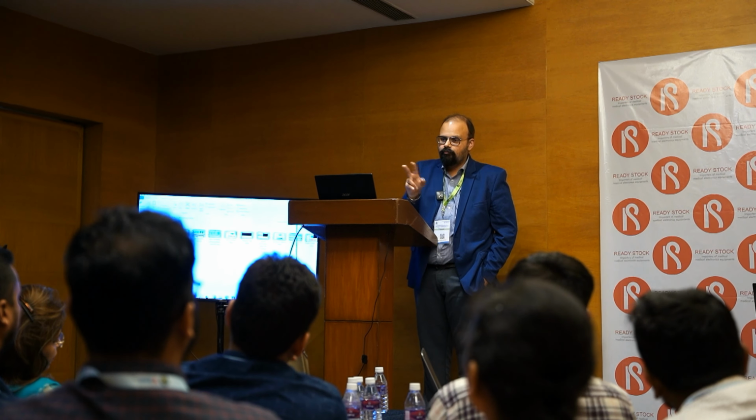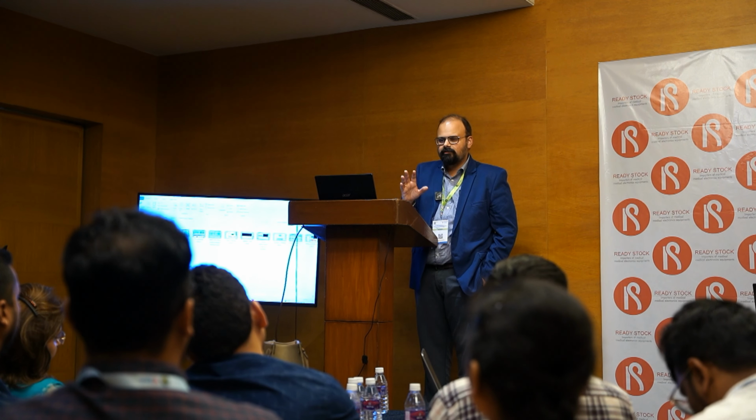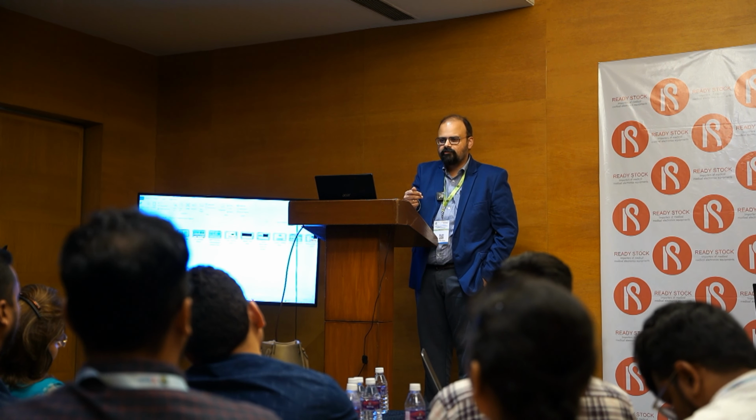You don't need to push him for a ARM. But usually it's pretty clear. History is clear. You do a PR, you feel that patient is not able to push. You do a manometry and objectively define it. But yeah, you're right. If the patient is able to pass a balloon in OPD, you may not ask him to do a whole test.